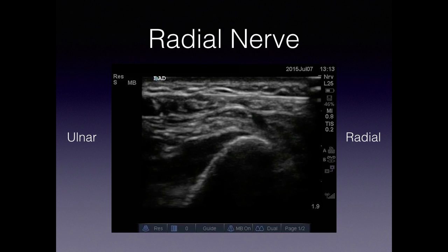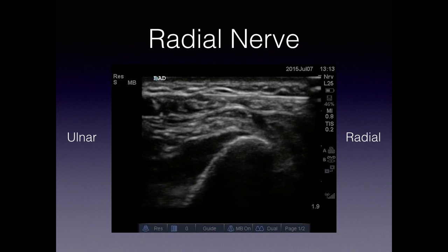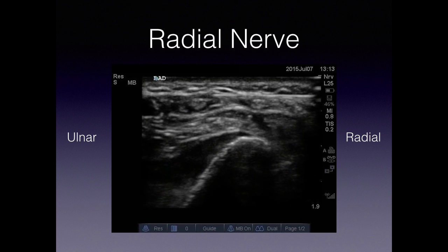Once we start to inject that lidocaine, this nerve is really going to come out and you'll see it dissect away from those fascial planes, allowing you to know — even before the patient has pain control — that you've done a successful procedure.